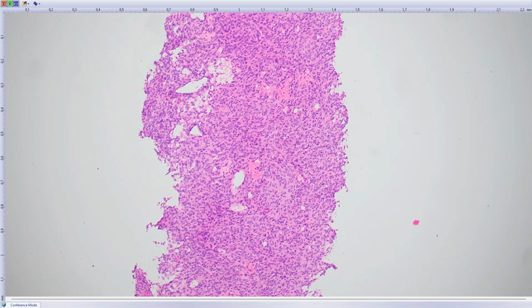That's the problem with soft tissue or mesenchymal tumors: unless you know the correct diagnosis, unless you can accurately classify the lesion, it's hard to predict the behavior. But in any case, what we know is this is a pelvic tumor. Whenever you have a tumor in the pelvis or retroperitoneum and it's composed of spindle cells, the first thing you should rule out is dedifferentiated liposarcoma. So this was MDM2 negative by immunohistochemistry. So that's most likely not dedifferentiated liposarcoma.